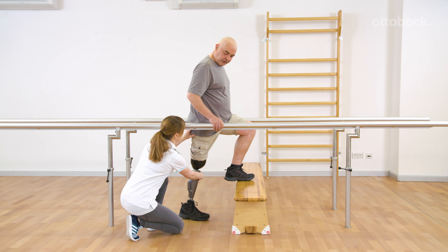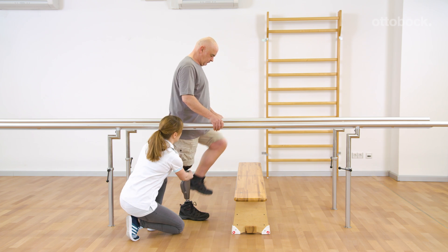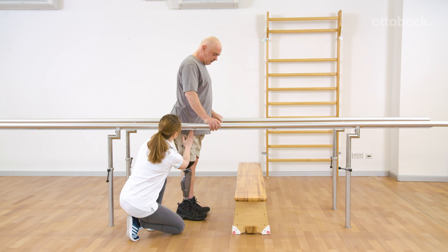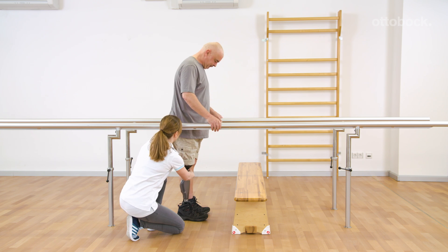During this second repetition, Franziska tells Gerhard to actively initiate swing phase by pulling the residual limb into flexion after the knee is extended. This is important for a deeper understanding of the functionality within the knee joint.